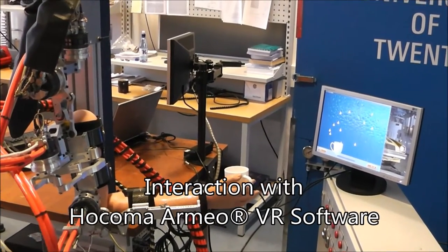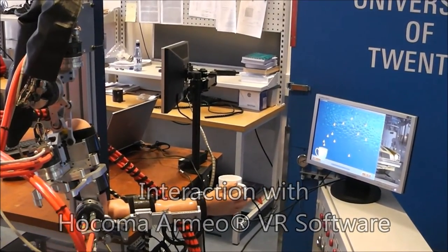The LIMPACT can also interact with the virtual reality software from Hocoma.